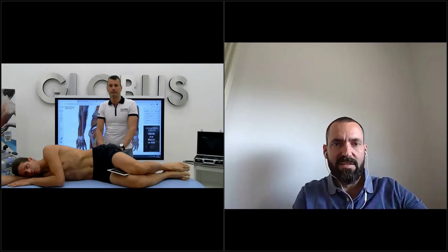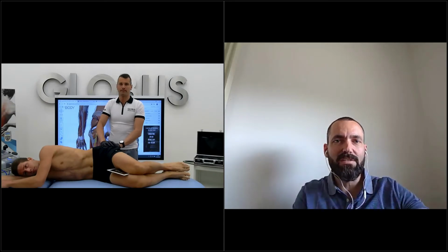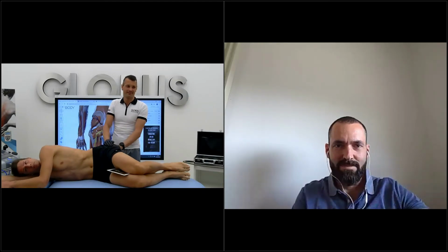I find the insertion of the piriformis, and of course in this position I already treated the other muscles too, the external rotators of the femur, as you showed before.